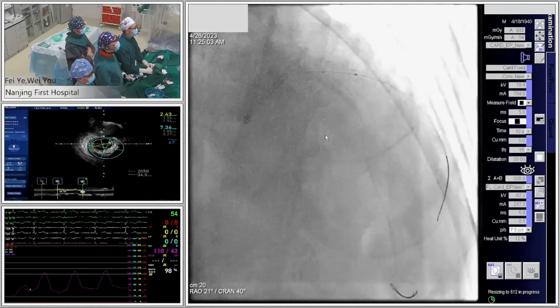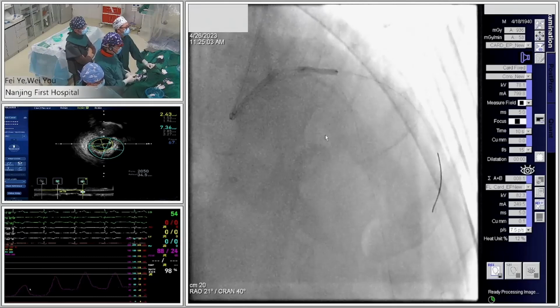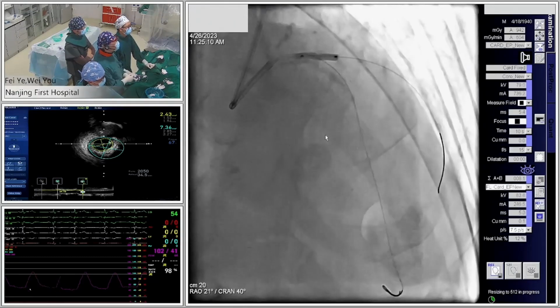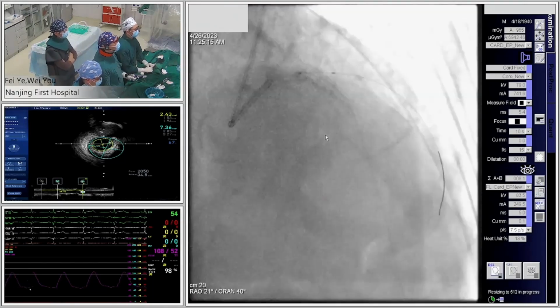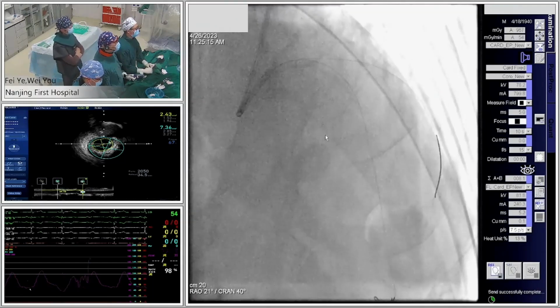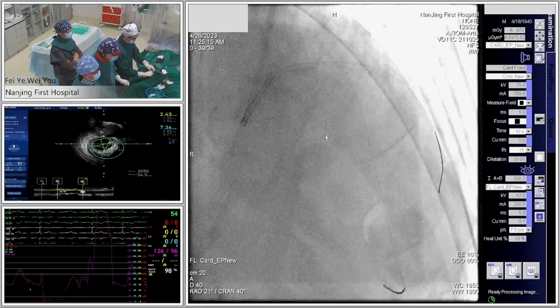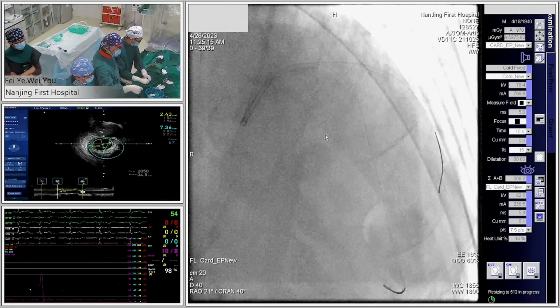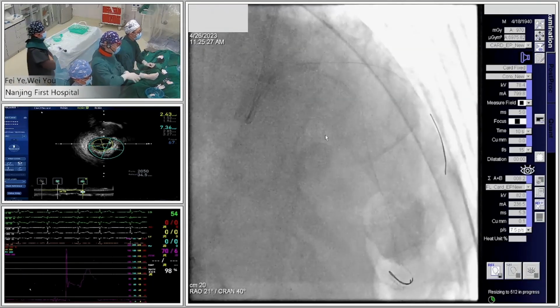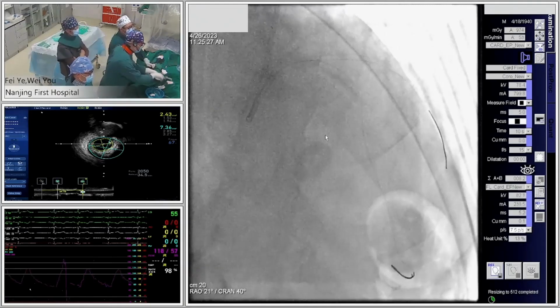To prepare the side branch ostium very well before stenting. Here is 14. Okay, down. After preparation, we also can check IVUS, or we can use an NC balloon to push this so that there is low resistance. We can put a stent across the lesion. And if we check IVUS, now check the angio first, to show the flow is ready. Okay, angio.